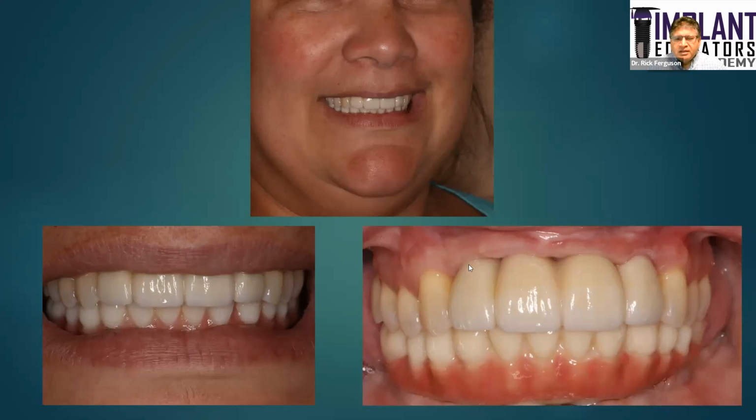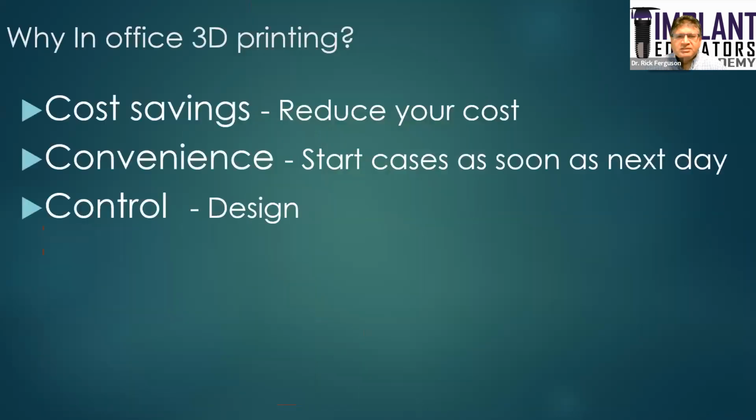So of course, we could go back and do crown lengthening on these teeth and make the canines look bigger and so on. But this patient was quite happy with the result. Finances are a little bit of an issue for her. It took all it could to get to this stage. So she was quite happy with the result, and that's, to me, success.